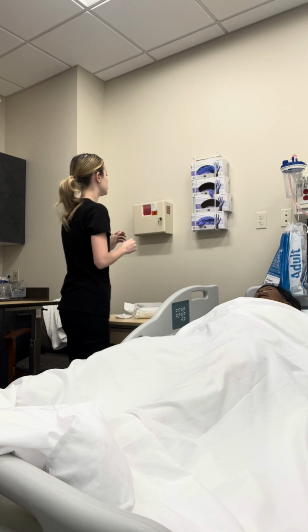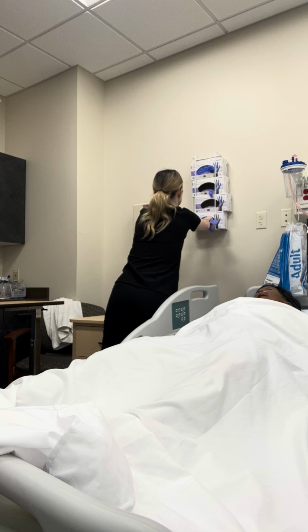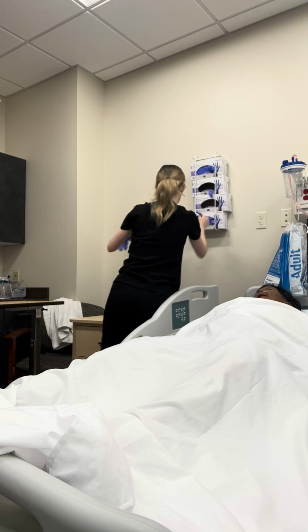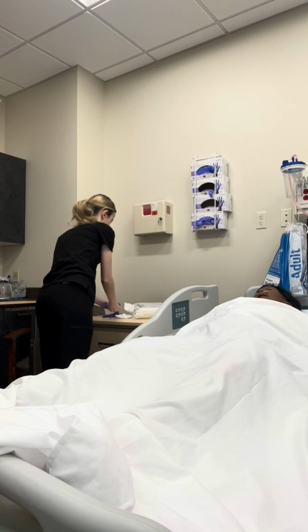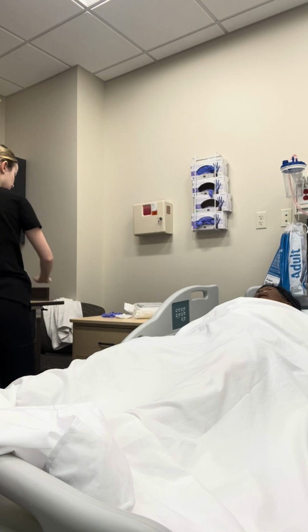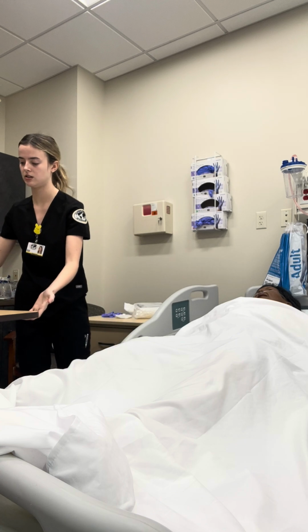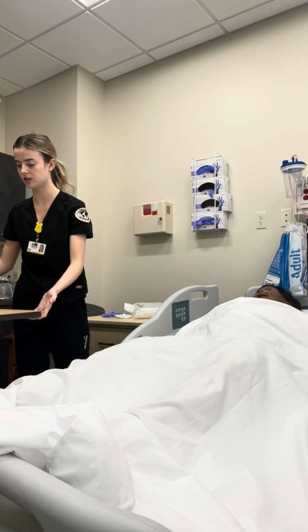I'm going to set out a clean pair of gloves for after the catheter is put in. And then I would clean this table, and this is the table that I'm going to be using to set up my sterile field.